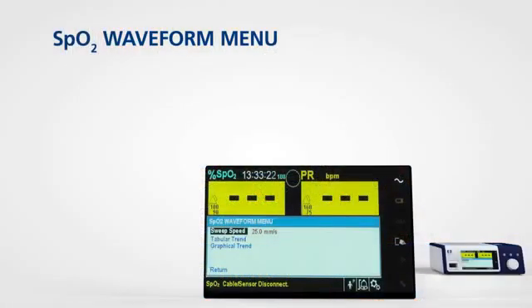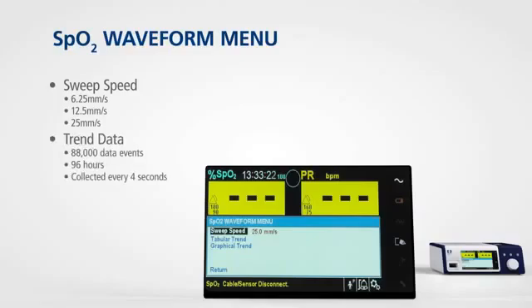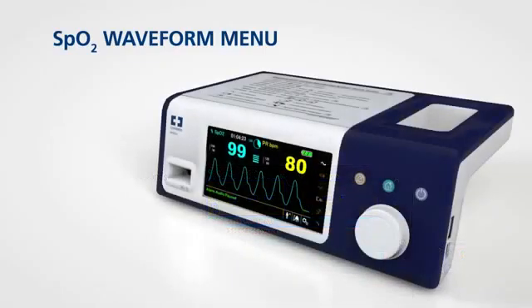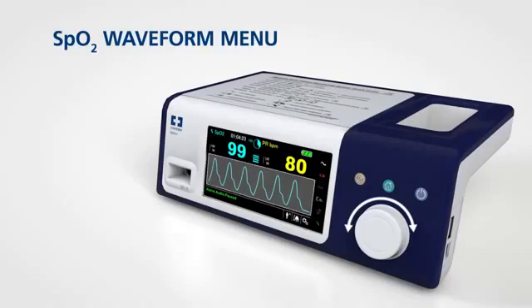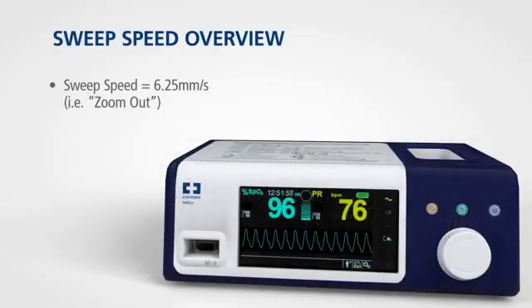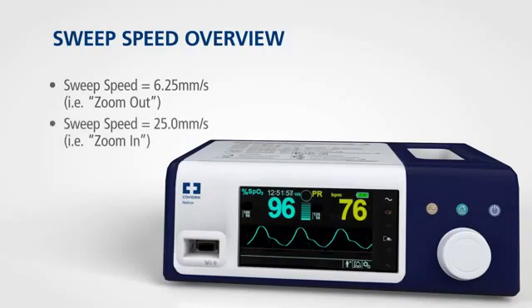The monitoring system allows you to set the sweep speed of the waveform and opt to view the tabular or graphical trend screen. To access one of these functions, simply rotate the jog dial to highlight the waveform or trend display area and press. The sweep speed view allows you to set the speed at which the SPO2 waveform trace moves across the screen — the higher the sweep speed value, the more granular the data that appears on the screen.